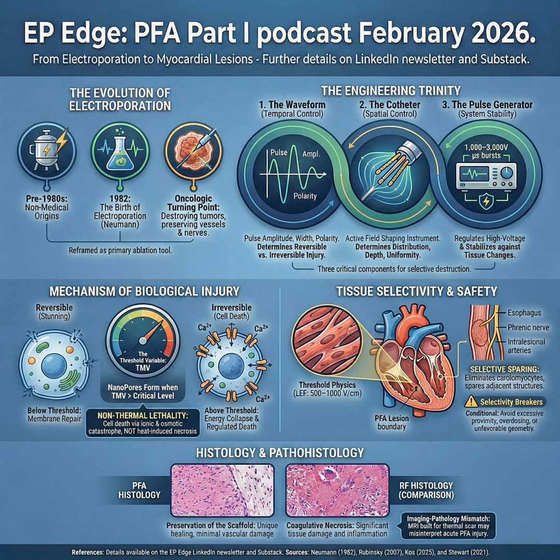Cardiac EP already relies on focal tissue destruction. The question was, can we do that destruction in a way that reduces collateral injury? And that brings us to the heart's own earlier history with electrical ablation. Let's zoom out for a second and talk about the ablation timeline in cardiology. Before catheters, there was surgical ablation.